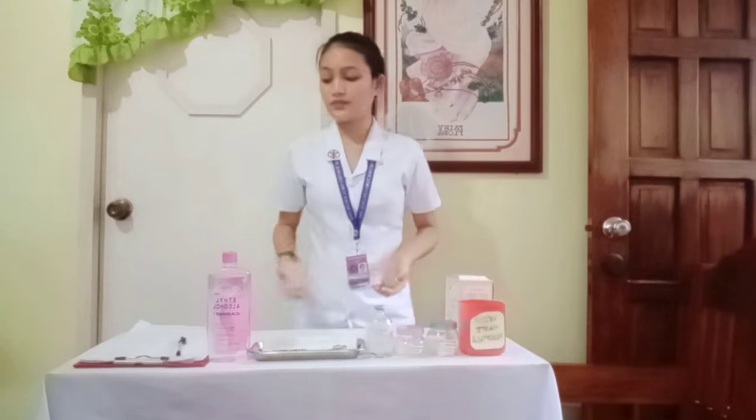Preparation of intramuscular injection medication. So the doctor has ordered 5 milligrams of morphine sulfate to address the pain of a patient sustained from a recent car accident which has caused him severe pain and injury at his right arm. Before we could actually draw the medication from this vial, we first need to do the mathematical calculation of the exact dosage needed.